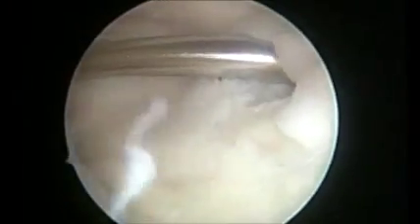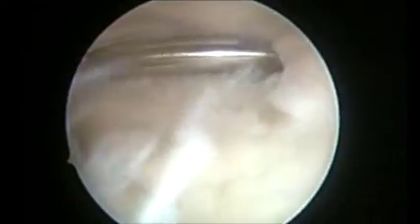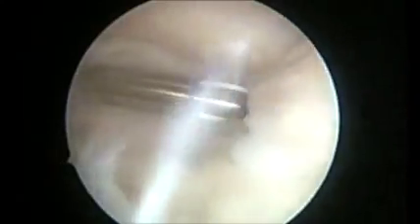It is very important to mention here that while using motorized shaver in the posterior compartment, the suction should be very low, otherwise you can damage the neurovascular structures in the posterior compartment.